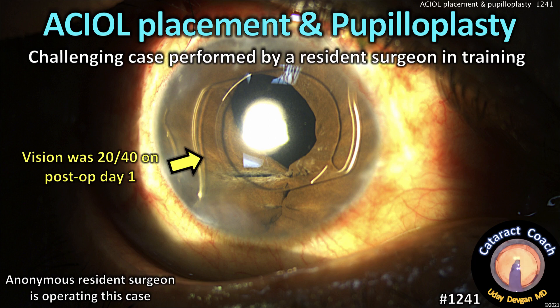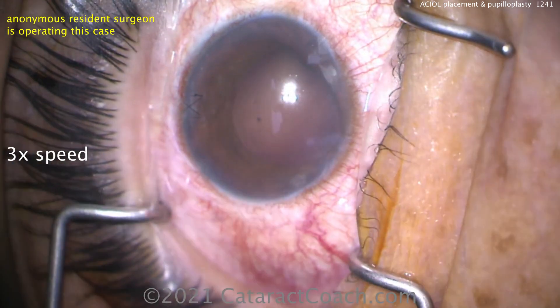Cataractcoach.com. This video covers ACIOL placement and a pupilloplasty — a challenging case being performed by a resident surgeon in training.